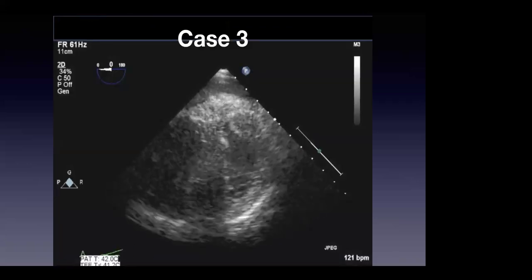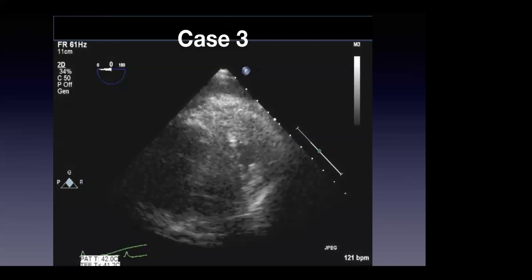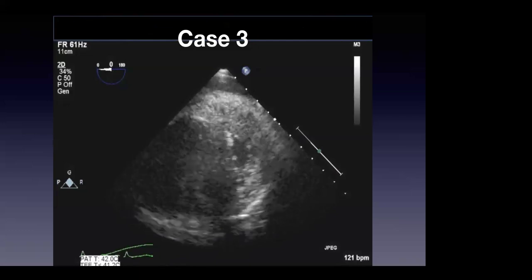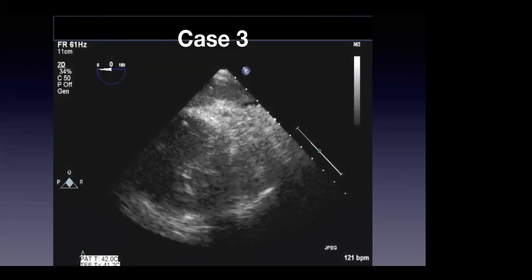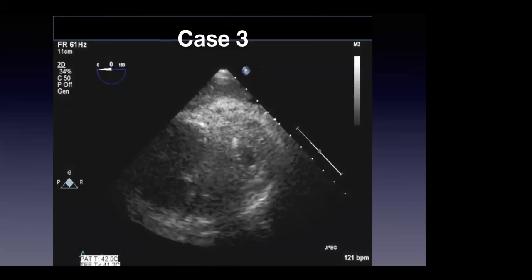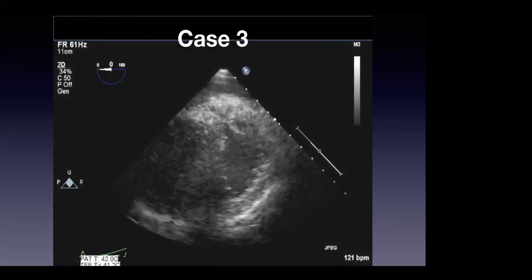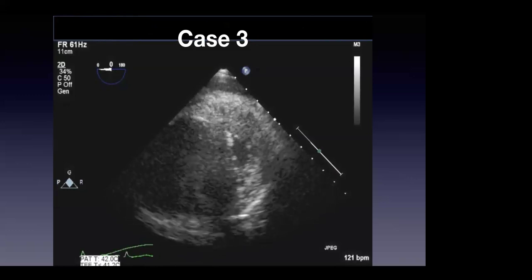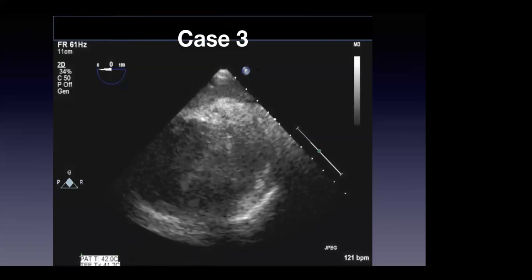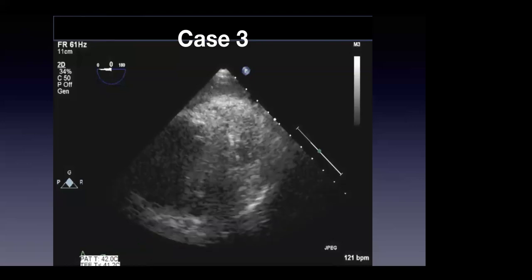Okay. All right. Case 3. Maybe we'll ask one of the fellows to describe it. This one was a TEE, in part because the transthoracic images were very, very poor. So, Mike, you want to? This is a transgastric view. The left ventricle looks small, hyperdynamic. There's flattening of the septum, like a D-shaped septum. The right ventricle looks very large. So dilated RV, hyperdynamic small LV, flattened septum.